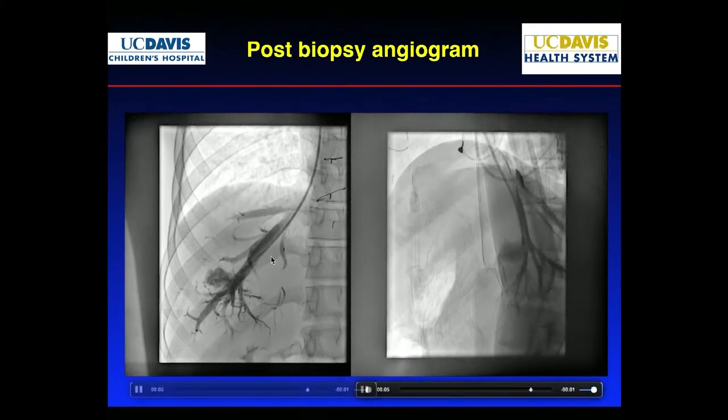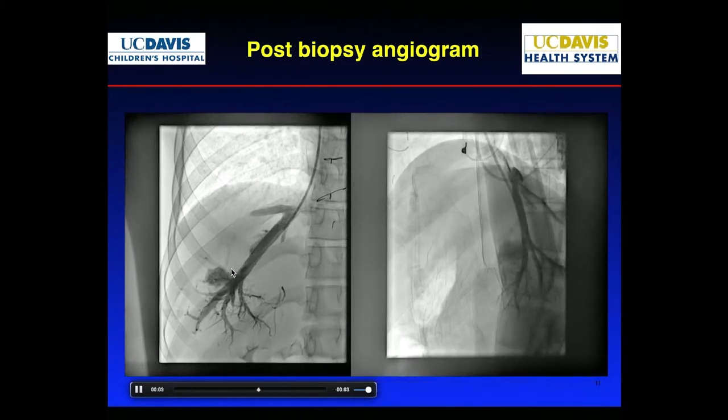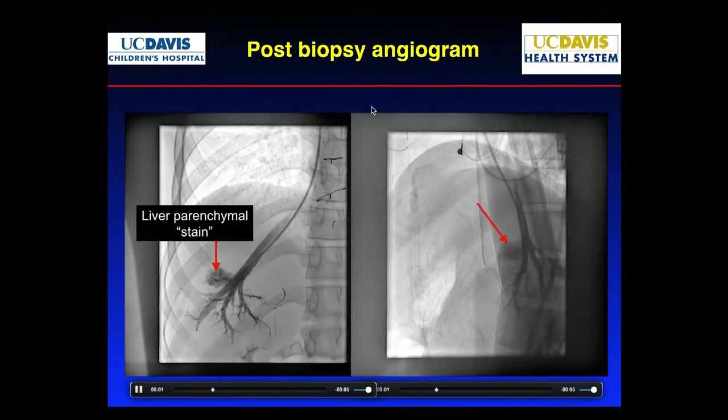It's not uncommon to see a little bit of a stain in the parenchyma, but again, I'm not that worried about bleeding because it just bleeds back into the veins, right? What you don't want to see is blood in the retroperitoneum, and that scares you. So the reason why it's important, let's go through the anatomy a little bit here.